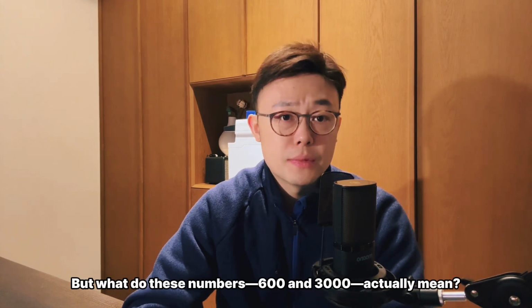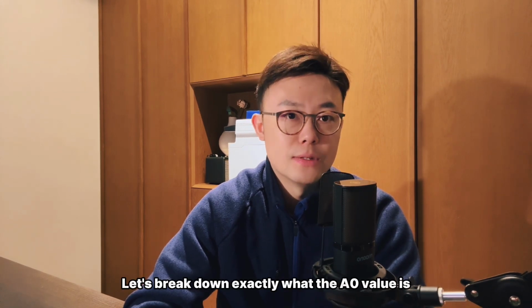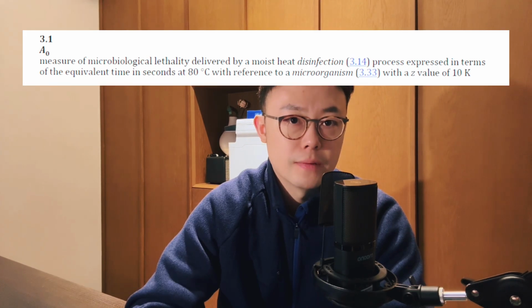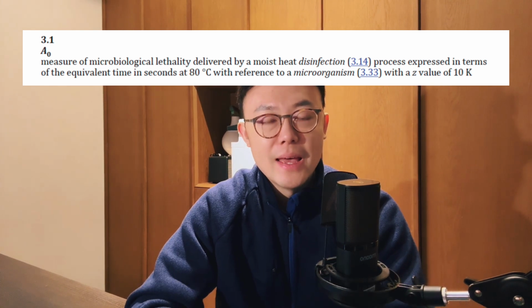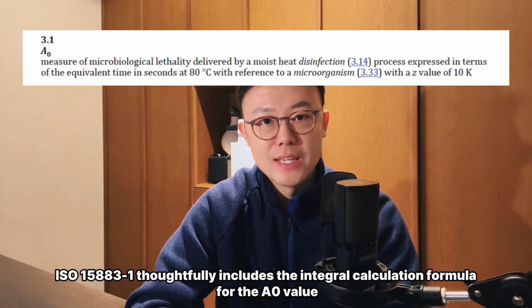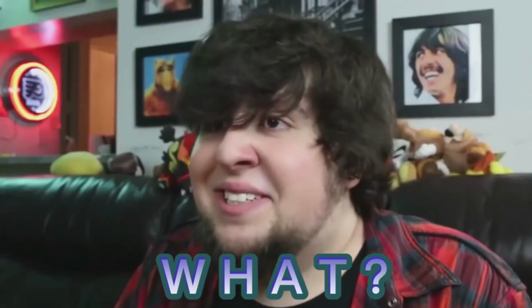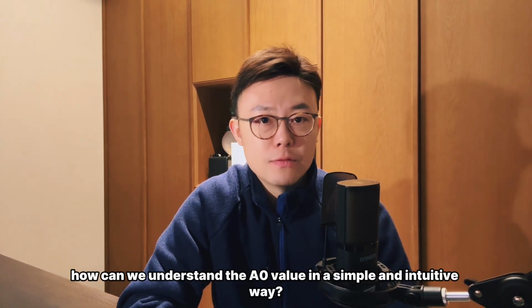But what do these numbers 600 and 3000 actually mean? Let's break down exactly what the A0 value is. Firstly, let's have a look at the official definition of A0 in ISO 15883. Yes, it is quite technical and difficult to understand directly. And to make the concept even more intimidating, ISO 15883 thoughtfully includes the integral calculation formula for the A0 value. What? So how can we understand the A0 value in a simple and intuitive way?